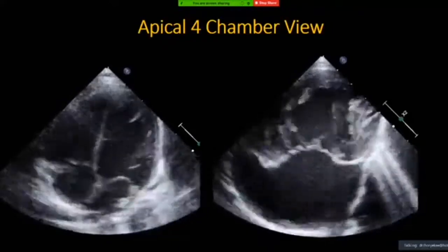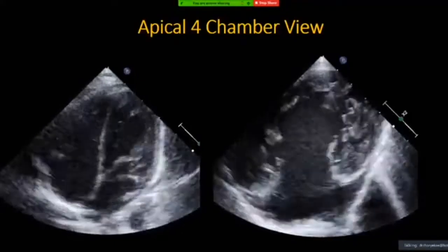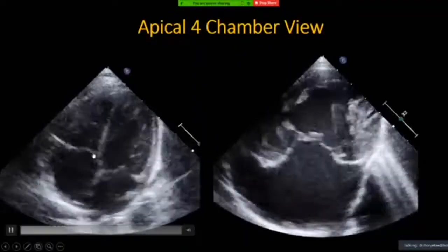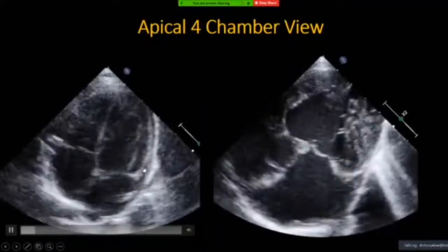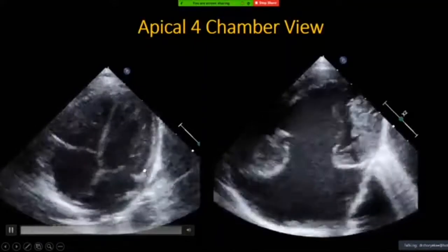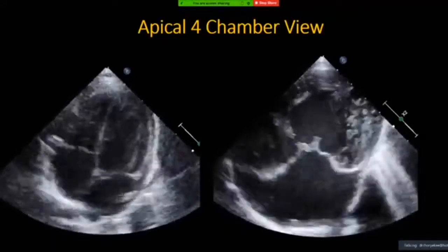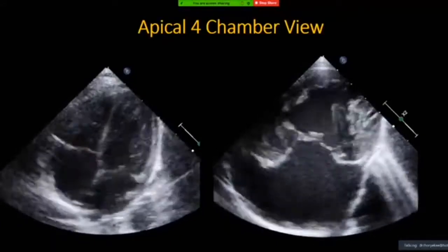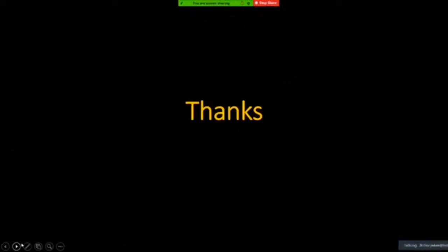We're not teaching that to get the diagnosis, but at least identify the normal chambers. At least we know that there are only 2 chambers. When you see 2 chambers, it's equivalent to maybe a univentricular heart, and it is most likely a cyanotic heart. Hence, in management, the saturation target will not be aimed too high, in our day-to-day practice. So we went through the basic probe, the basic window and basic view. Hope that this will help.